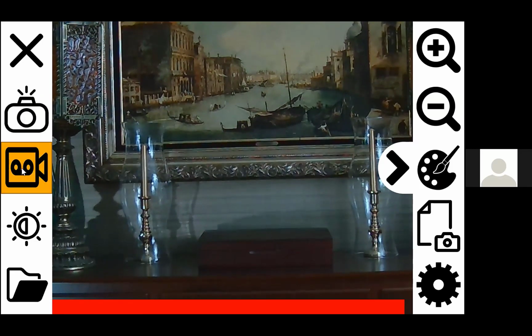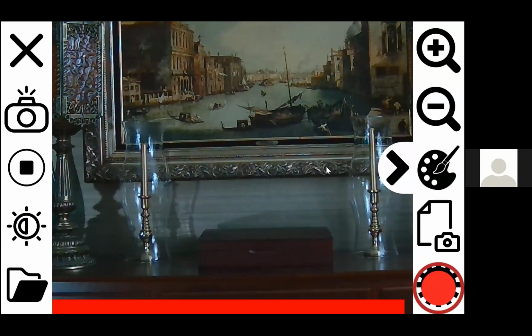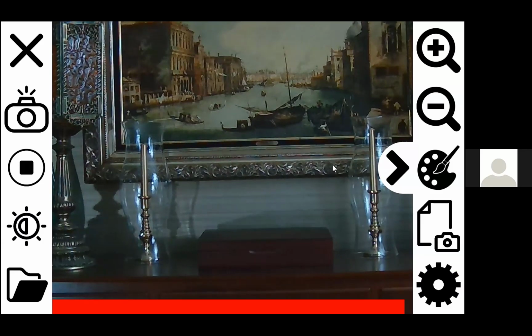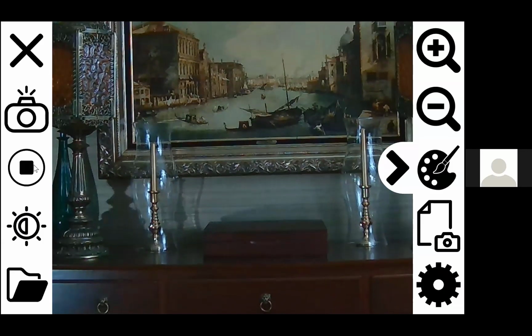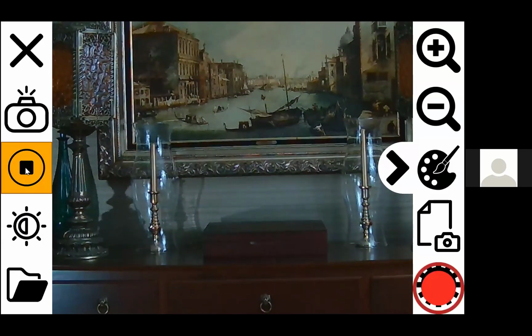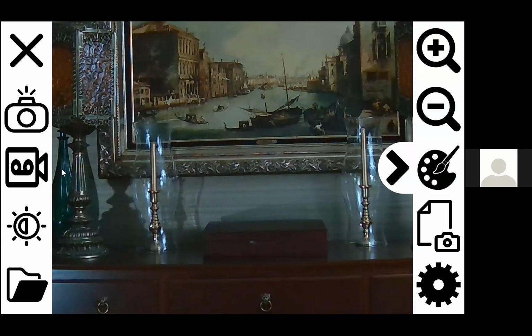Yeah. And so with that live view, I'll also just show you here on the left-hand side, that record button. So when I click that, it gives me an auditory noise to let me know that it's recording. And then it gives me a visual down the bottom right-hand side. That's a big red dot, kind of bullseye blinking, letting me know that it is recording this. So whatever I see on the screen here, it's recording and putting that into, when I save it, a file. So then that record button on the left-hand side now becomes the stop button. And when I click that stop button, again, I get a little auditory noise letting me know that it's stopped. And if I then want to access that, I can click on the folder down the bottom left.